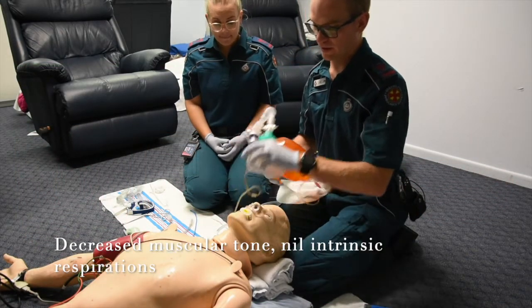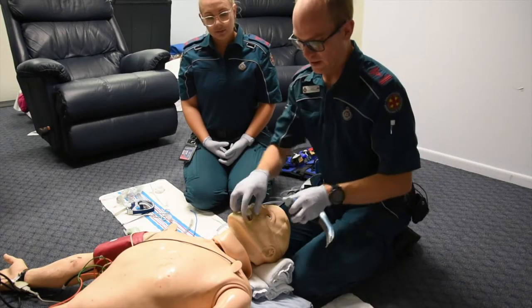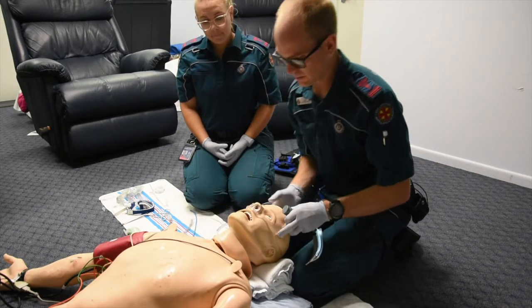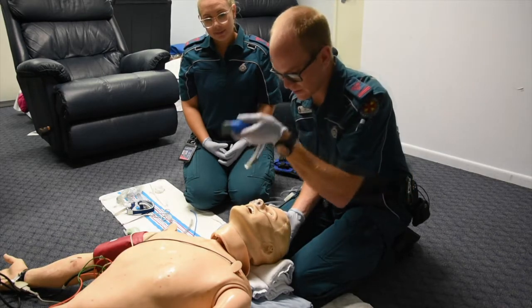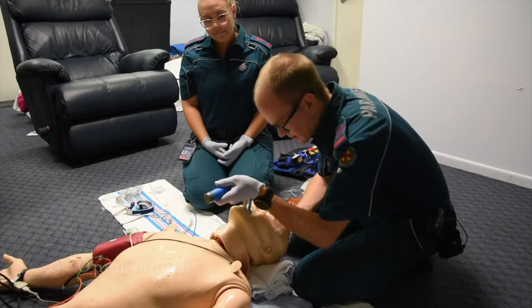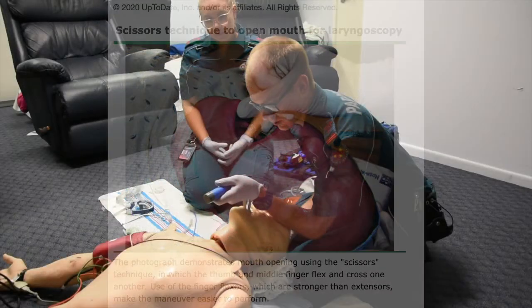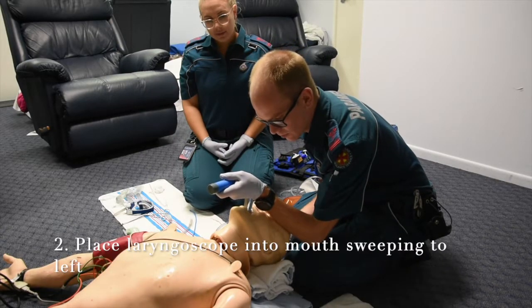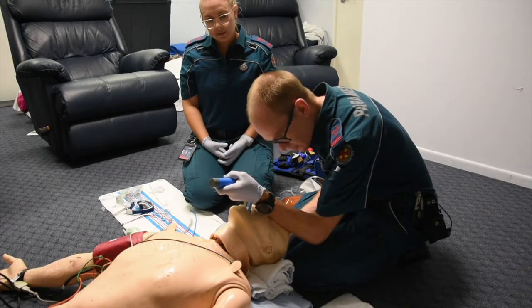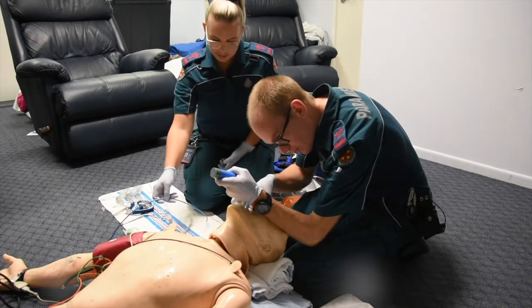One more ventilation. Alright, we're aware that when the saturations get below 90%, that alarm will alert me. Okay, so OP out, OP to my right, bit of head tilt. When I place the laryngoscope into the mouth, I've got a decent mouth opening. I can use a technique if needed, shown here. I'm looking down the mouth, I've got a view of the uvula, I'm also looking for the tonsils. I've swept everything to the left and placed it in the vallecular groove. I have a grade 1 view of the chords.